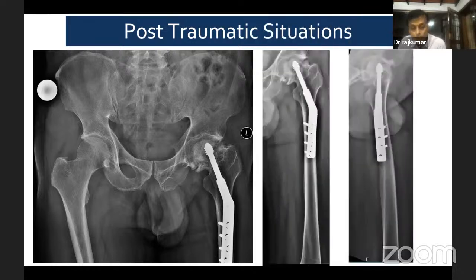The key point here is you have to take a proper lateral view. Just see the lateral view. How much bowing is there in this case? In this situation, you have to be prepared to address this bowing. The problem is that all the distal loading stems are straight stems, not bowed stems. A cobalt chrome stem has long bowed stems, but short distal loading stems like the Wagner 190 and 225 are not curved. They are all straight stems.